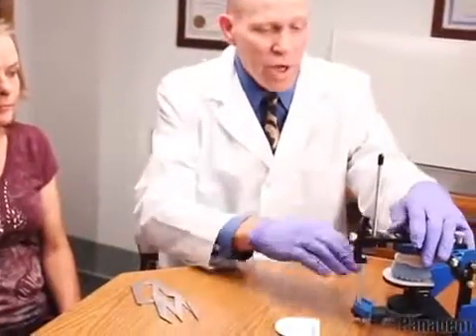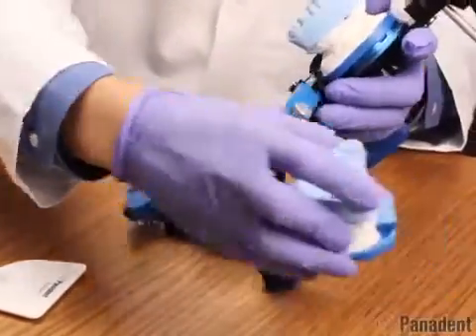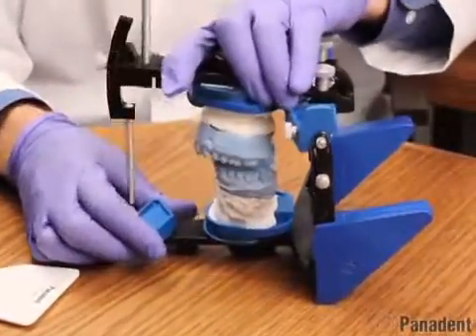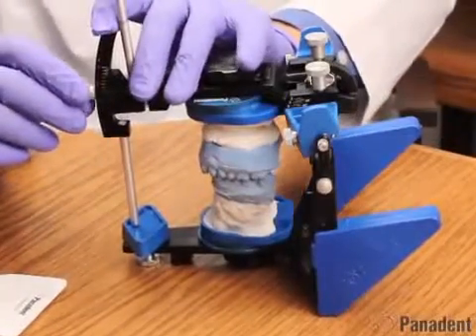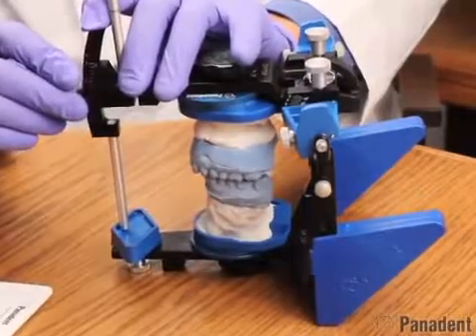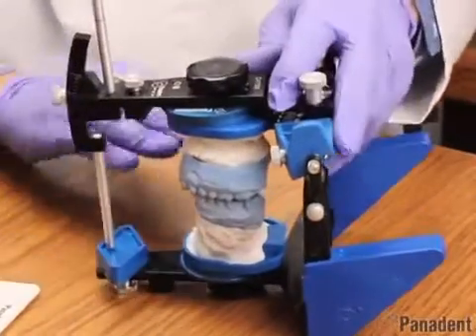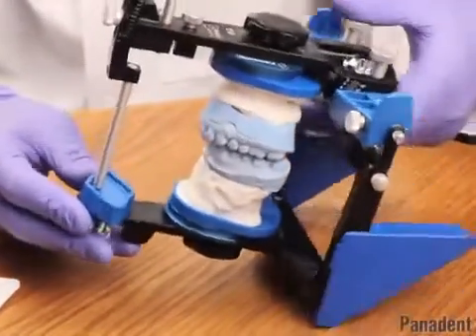If you did want to change vertical dimension of occlusion, you'd have your upper cast completed, so we can remove the platform, we then add the lower cast, and then we drop it down until the teeth occlude. And then if we want to increase vertical dimension 2 millimeters, we could raise the pin up 2 millimeters, and now the technician could wax in the lower teeth against the upper teeth in completing the case.